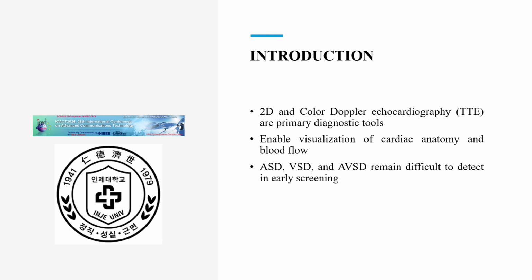Here I discuss the importance of echocardiography. Transthoracic echocardiography, or TTE, including 2D imaging and color Doppler, is the primary diagnostic tool for CHD. It provides visualization of cardiac structure and blood flow patterns. However, early screening of ASD, VSD, and AVSD remains challenging even for experienced cardiologists.